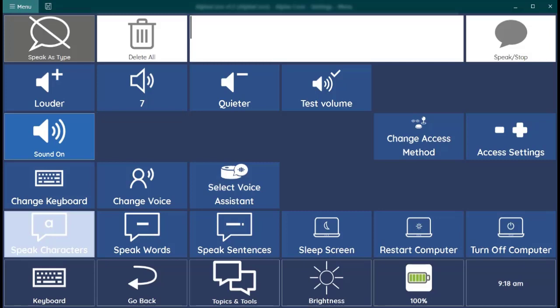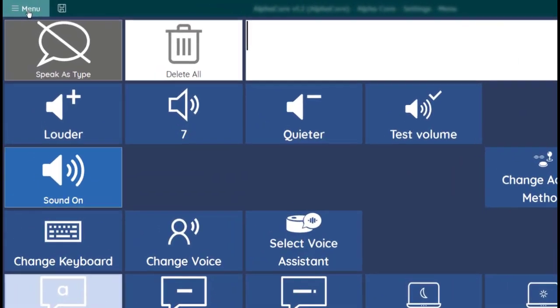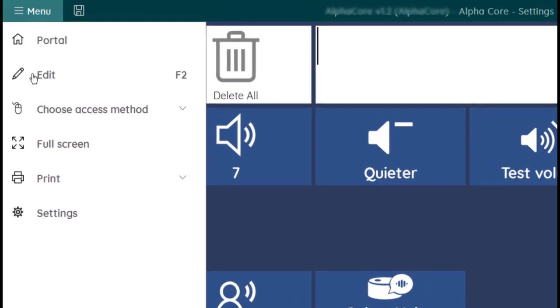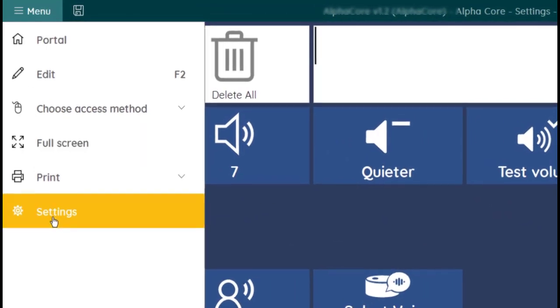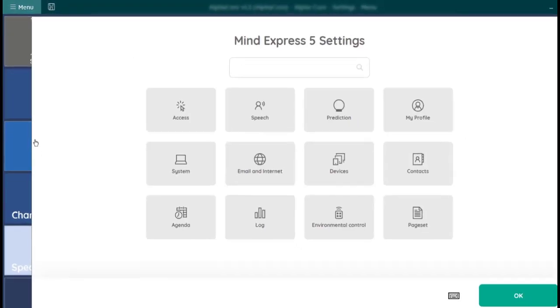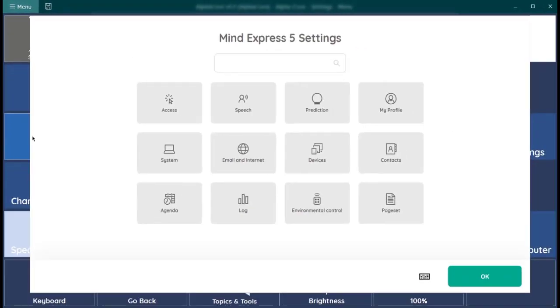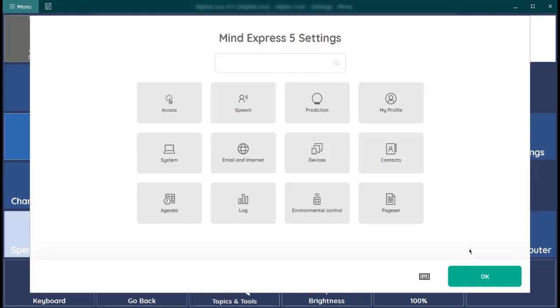Now the full set of all MindExpress settings can be found in the drop down menu under Settings, represented by a gear icon. Unlike the AlphaCore Settings page, this area is not accessible to people using eye tracking, dwell selection, or scanning, so a helper is needed to make changes in this area.